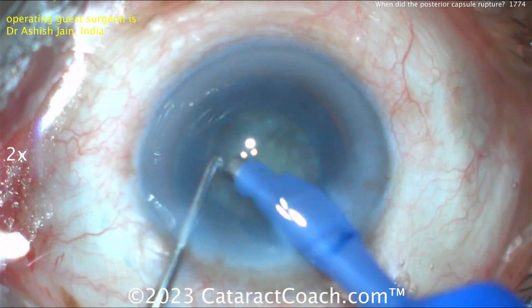We've sped the video up to show everything. Another sub-chop and now that quarter became two smaller pieces — that looks good. Aspirating it down very quickly and easily, then rotating. Everything looks fine so far. One quadrant came out of the eye, so more viscoelastic to protect the endothelium — looks like it's HPMC, hydroxypropyl methylcellulose. Good thing you can re-coat if you have a little extra ultrasound energy. Two quadrants remaining.